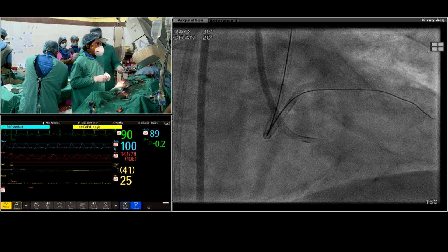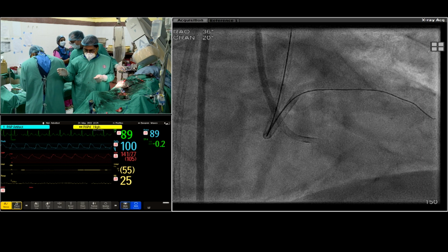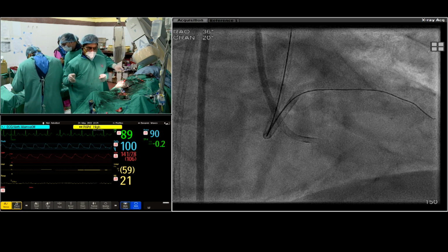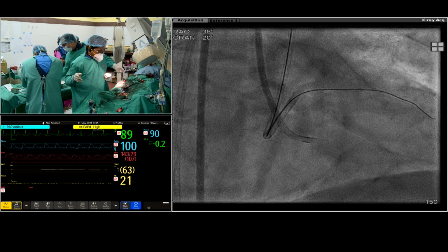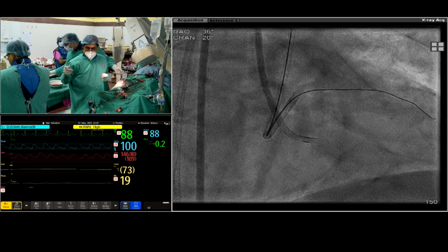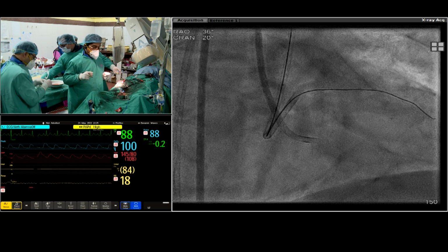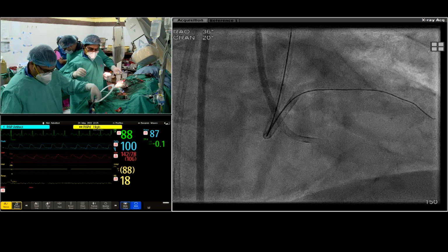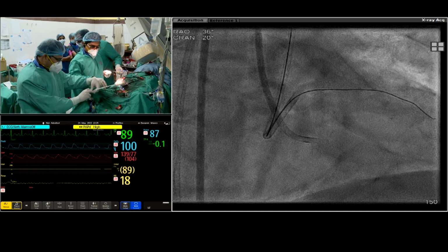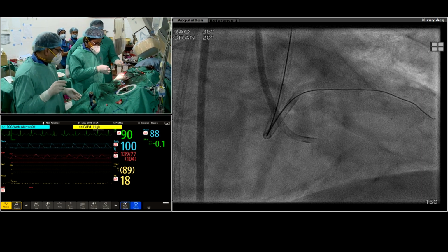Crusade. Keeping this balloon inflated doesn't make a difference? Nah, the pressure transmission would not be there. That is one issue. And secondly, whether there can be any thrombosis because of that? No. That is all heparinized. Tell me when it is 1 hour after heparin. Then we have to give 2,500 more. Thus, keeping this balloon inflated will keep the wire in place. Yes.